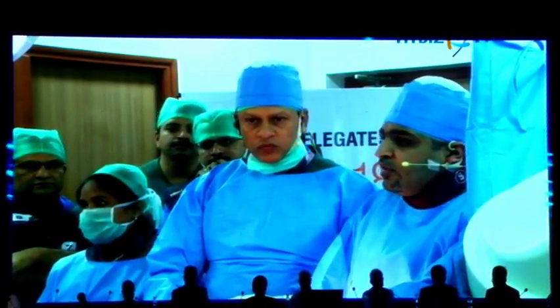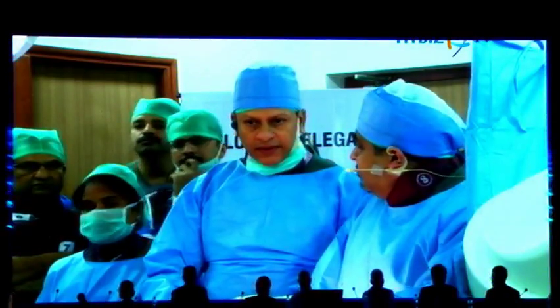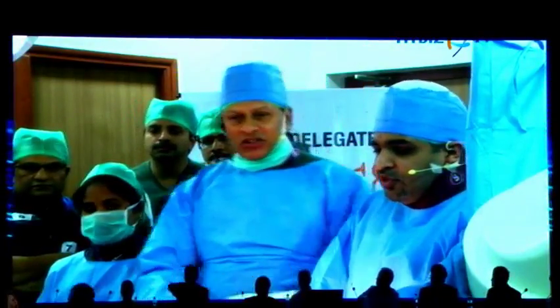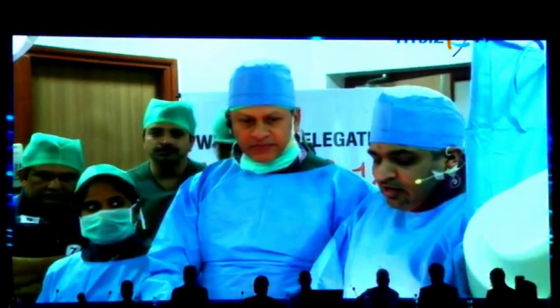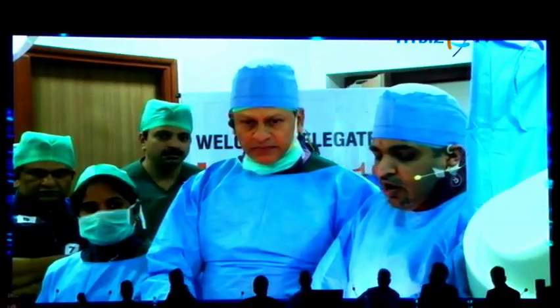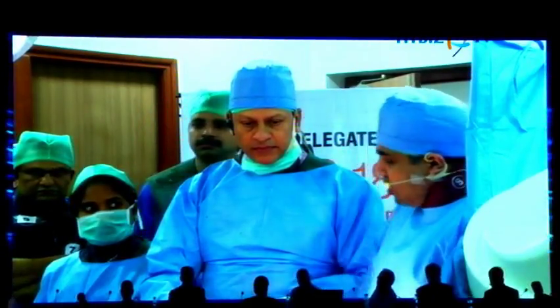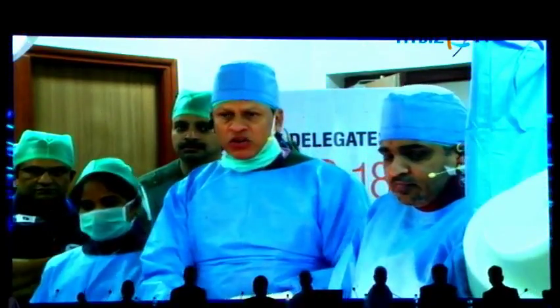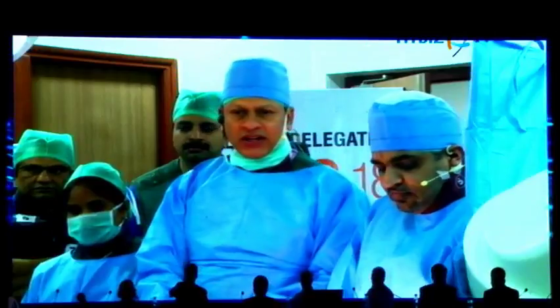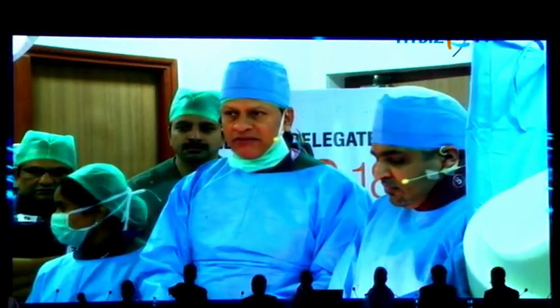Thank you very much for having me here with you, with this great team. I'm very happy to work with you in India. So I will let our colleague present the case today. It was already attempted 2 weeks ago, antegrade and retrograde. So he will present the case. Good afternoon, everybody. Greetings from Yashoda Hospital, Secunderabad. Thank you, the organizers, for giving us this opportunity to operate live on this case.